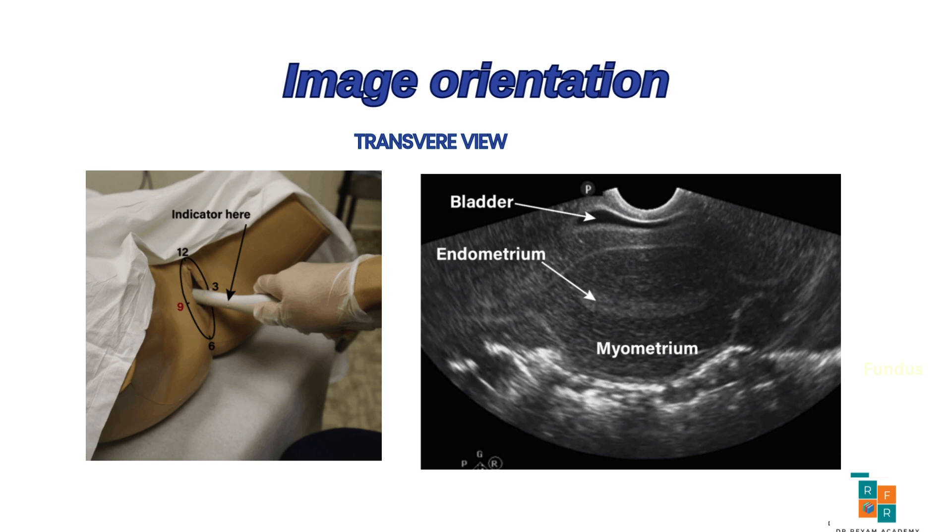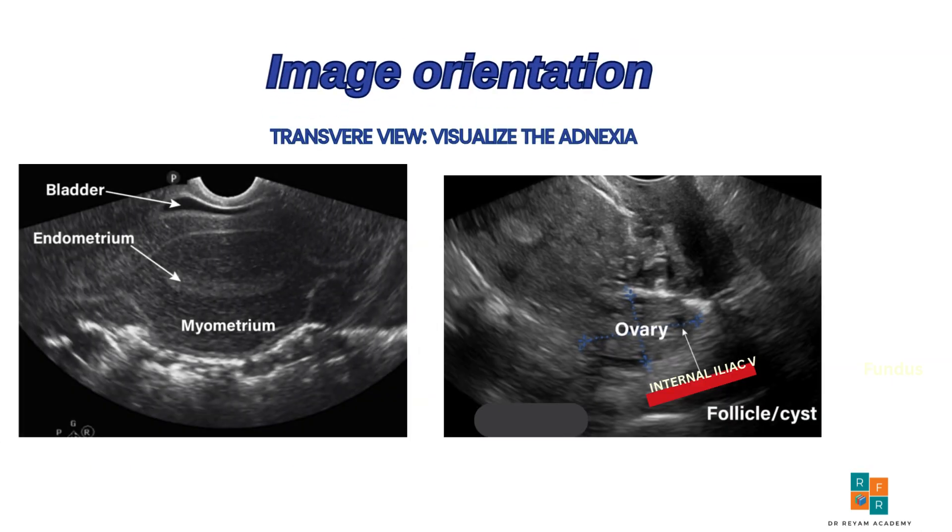Let's move further to identify the ovaries. To image the ovary, begin in the transverse plane at the widest dimension of the uterus. Then angle the probe toward the right side following the course of the right ovary ligament. This will guide you to the right ovary, which typically occurs overlying the internal iliac vessels.